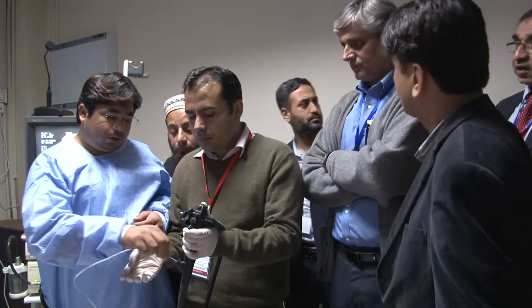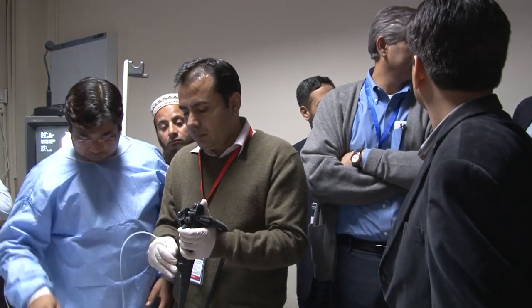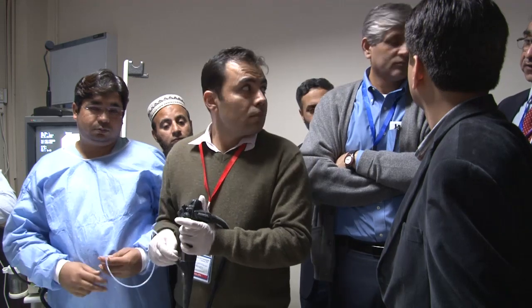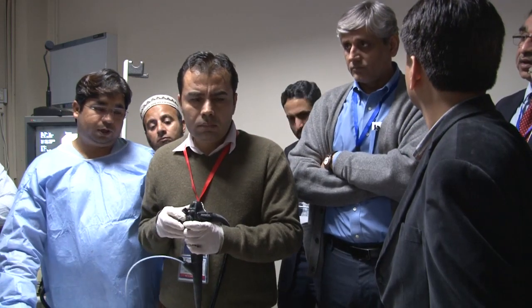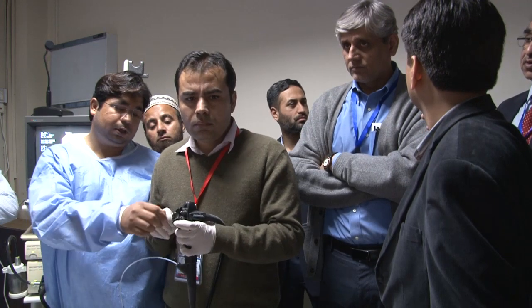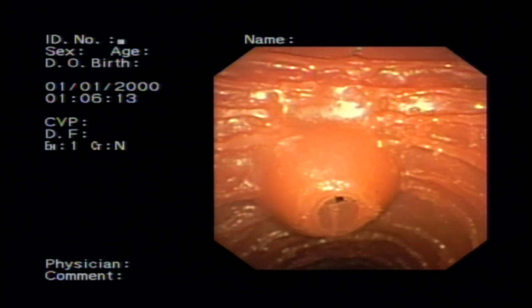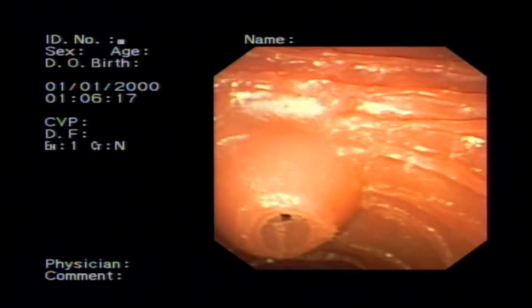दूसरा जो sphincteroplasty और sphincterotomy का जो concept है कि whether it causes a perforation or not, you have to compare it with episiotomy. अगर difficult labor हो, so you save a tear by doing an episiotomy. The same concept applies to sphincteroplasty. If you do a sphincterotomy before doing a sphincteroplasty, especially with CRE balloon, then it saves you a perforation.